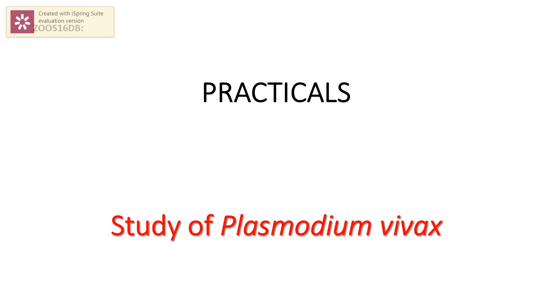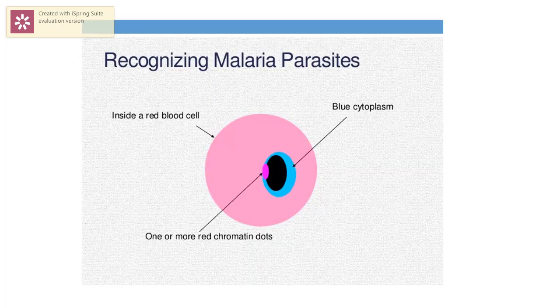This parasite is the most frequent and widely distributed cause of recurring malaria. Plasmodium vivax malaria infection can lead to severe disease and death, often due to splenomegaly. So, I will discuss here how to diagnose Plasmodium vivax in the RBCs of human samples.